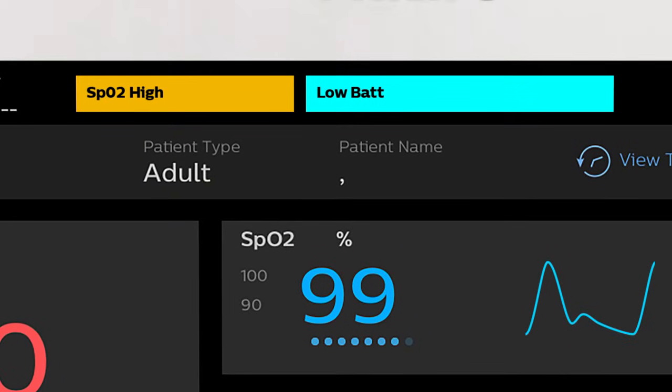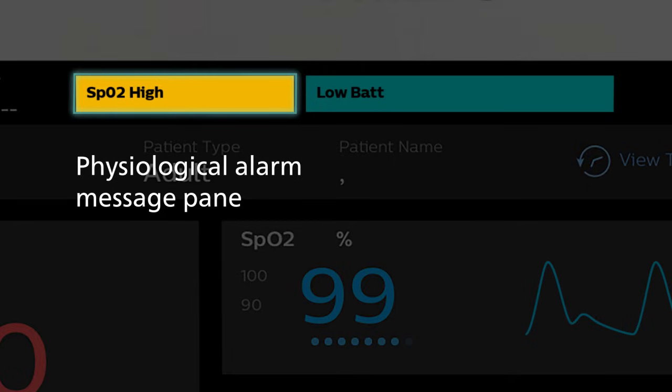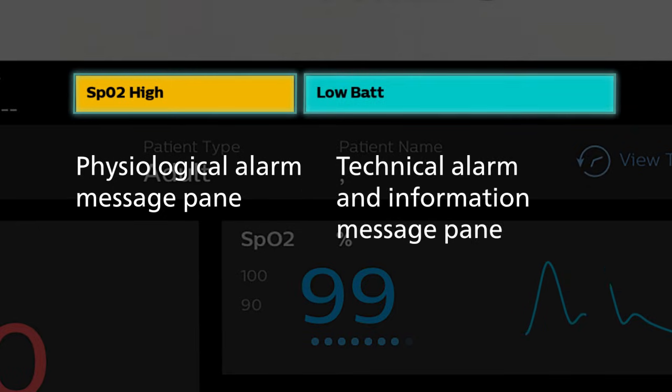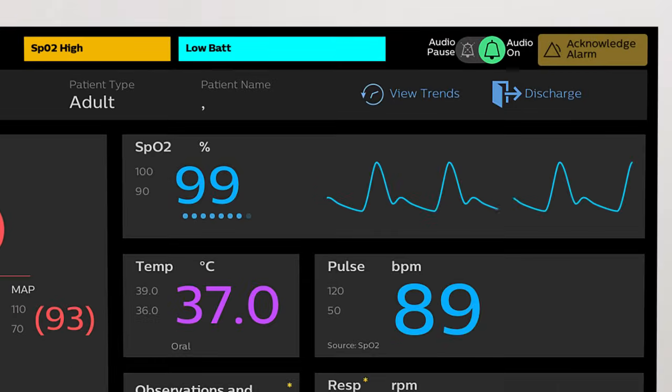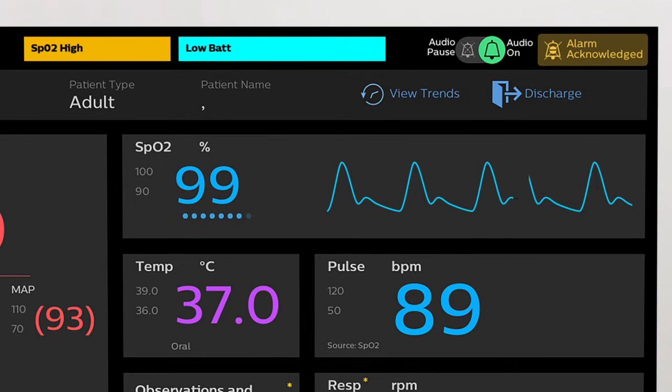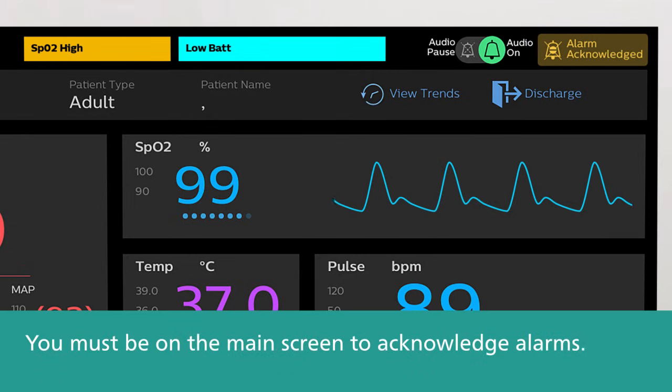Visual indicators appear at the top of the screen. Red and yellow alarm messages appear in the physiological alarm message pane. In-ops appear in the technical alarm and information message pane. Touch Acknowledge Alarm to silence an active alarm. You must be on the main screen to acknowledge alarms.